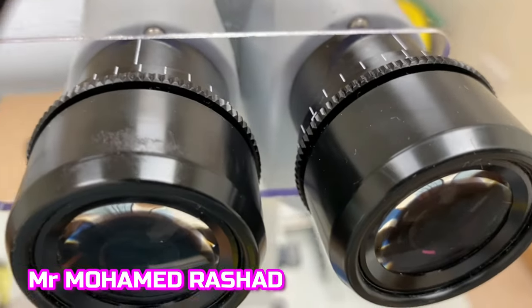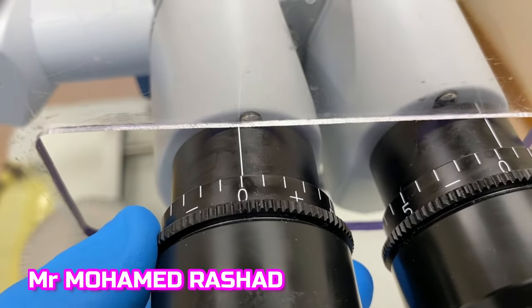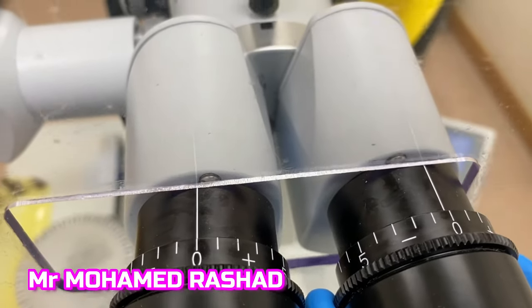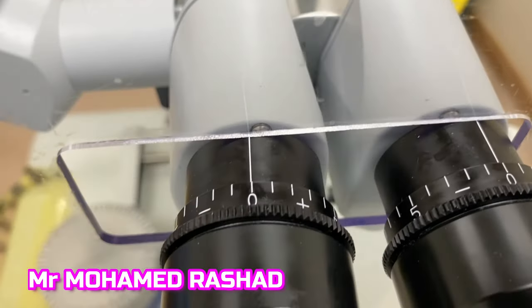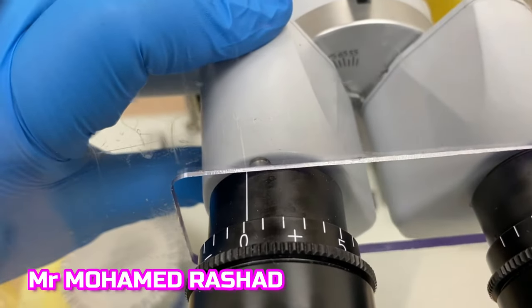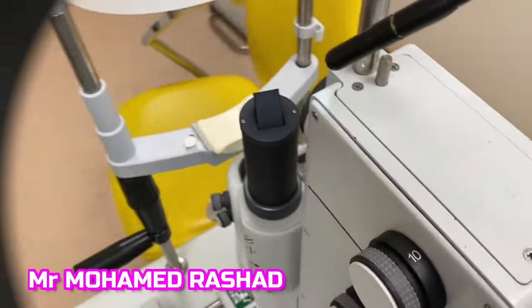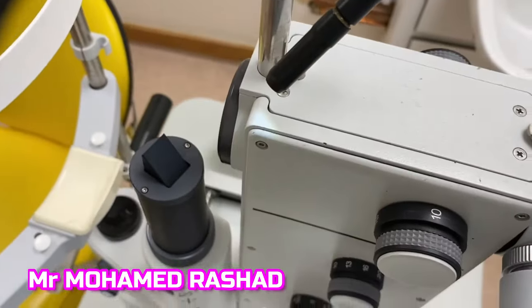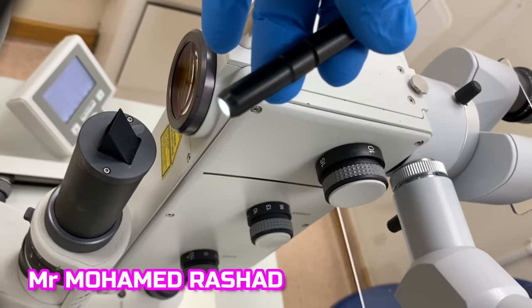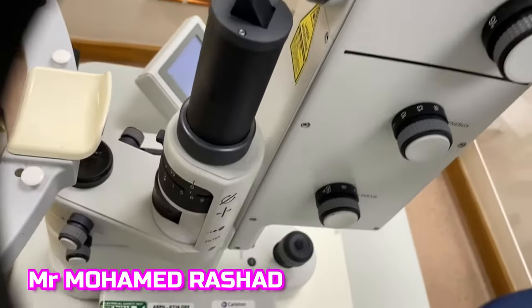Make sure you adjust the eyepieces to your refractive error. If you are using glasses you can put it on zero. The IPD has to be adjusted to have a binocular view.